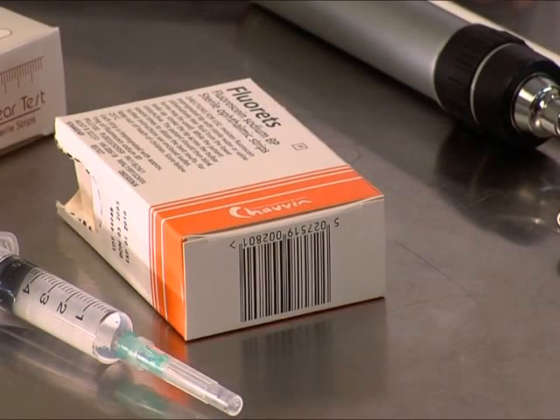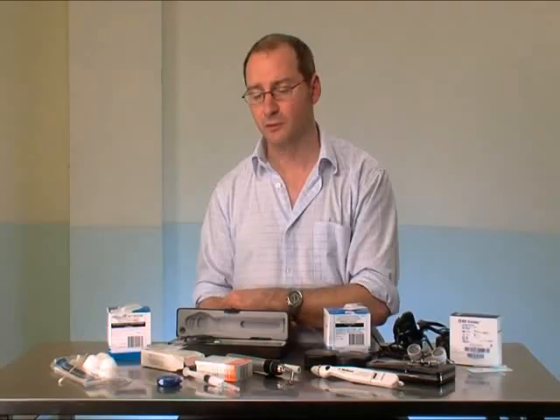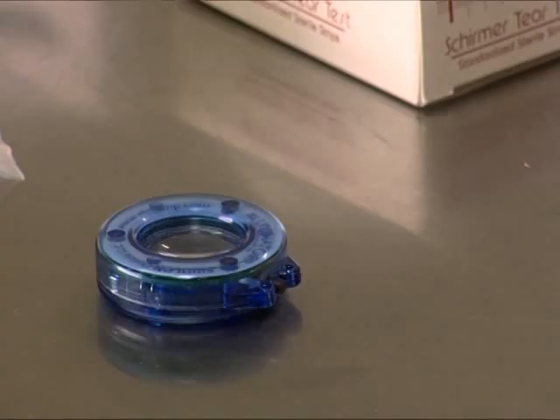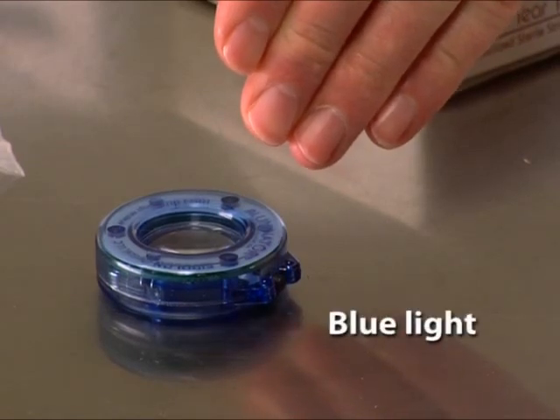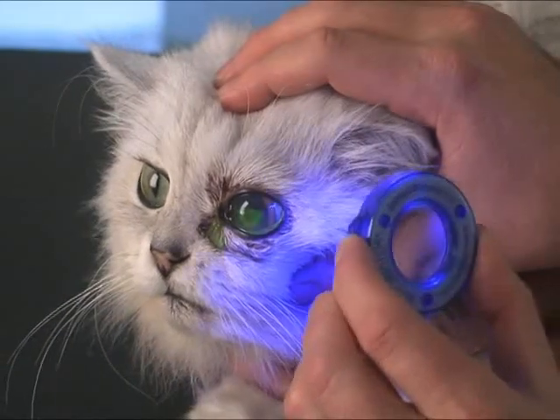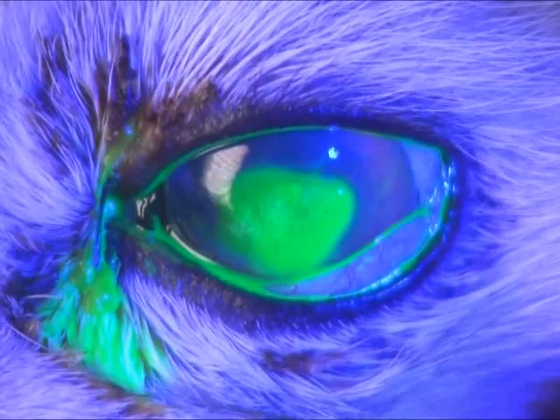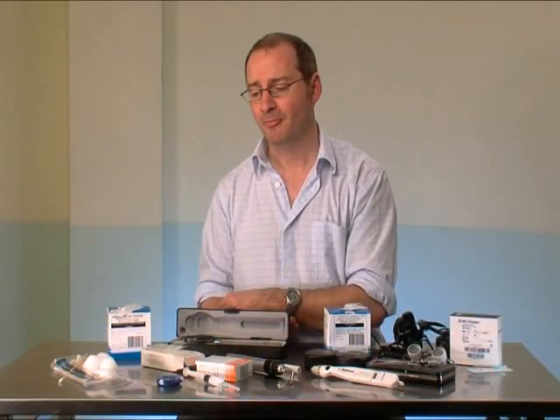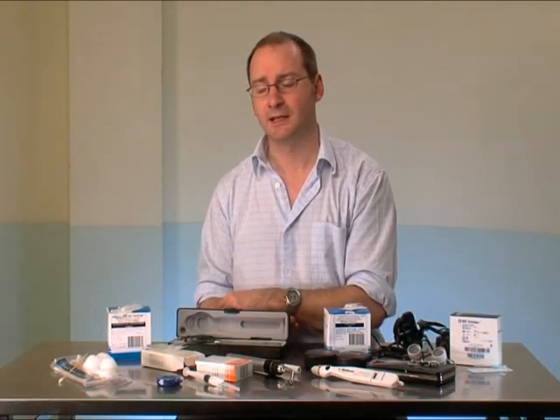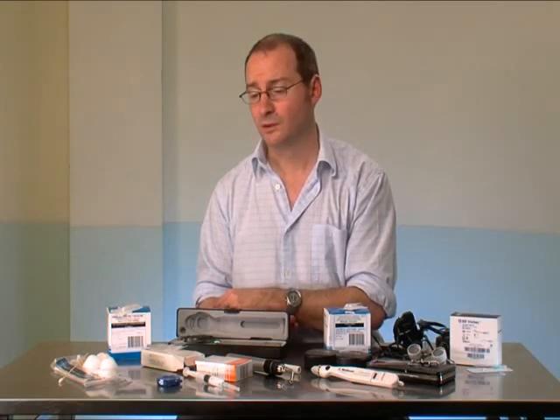The corneal integrity can be assessed by the use of fluorescein, and I would advise using fluorescein in just about every case that presents, particularly if there's any pain. To assess the fluorescein, it's very important to have some sort of blue light source. This will help amplify the return from the fluorescein stain. Many people in practice will have access to a Woods lamp, but that's actually an ultraviolet light and is probably not ideal for the health of the cornea or the eye.